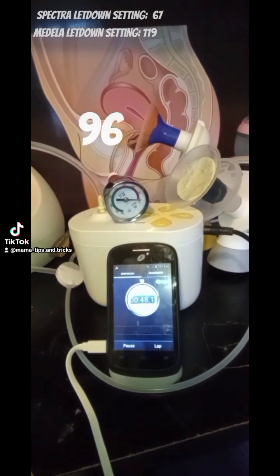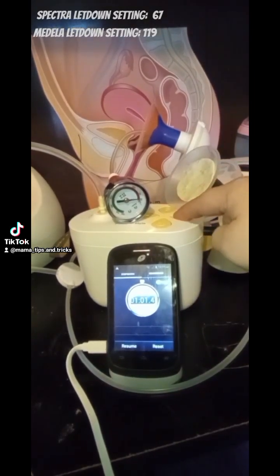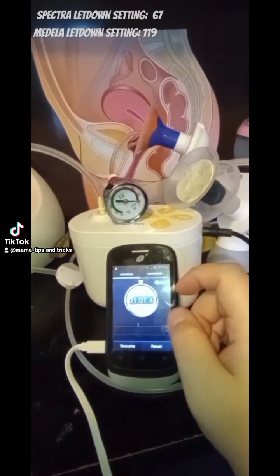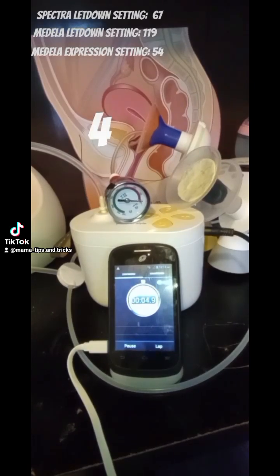The other one is going to be the type of vibration. Medela is much more of a tongue roll type of vibration, even though Spectra also has kind of a tongue roll type of vibration. It's not as long, if that makes sense. It's harder on the Medela, like it's got a harder vibration, but it's much faster.